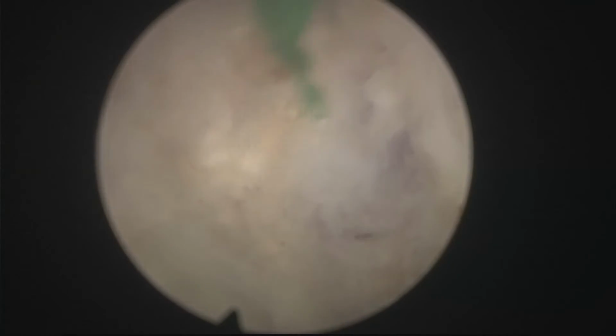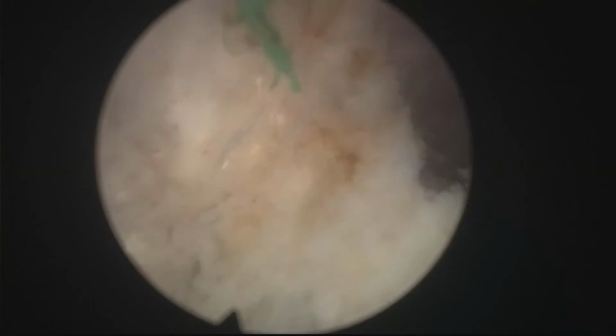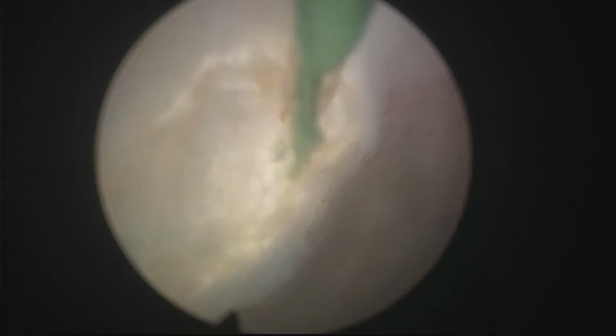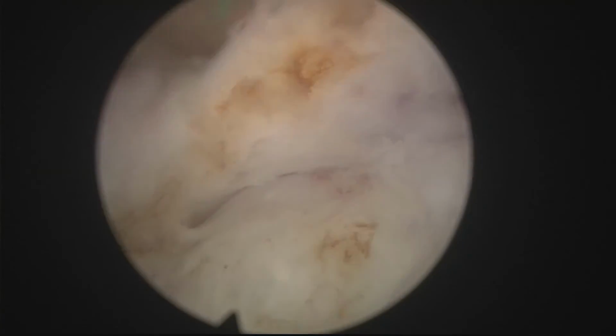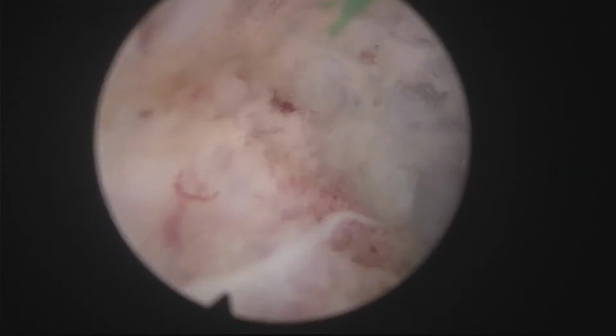Probably I was checking the water or something when I was stopping like that. So I took my eyes off the screen to do something. Often you have to do that.